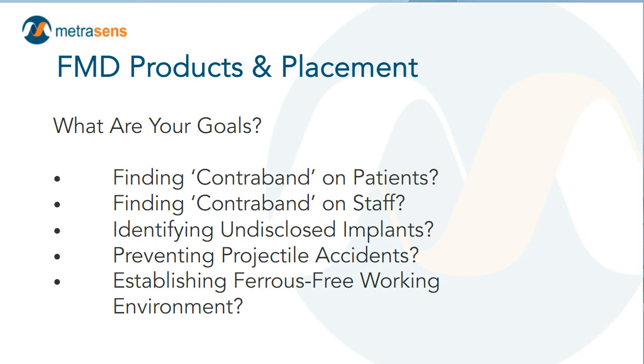Are you interested in finding implants, devices, foreign bodies that may be within the patient but weren't disclosed on the patient screening form? Are you really concentrated on stopping the big uglies, large projectiles flying into the magnet room? Or are you interested in establishing a ferrous-free working environment? Depending on what your goals are, they may describe different ferromagnetic detection products and different placements of those products.